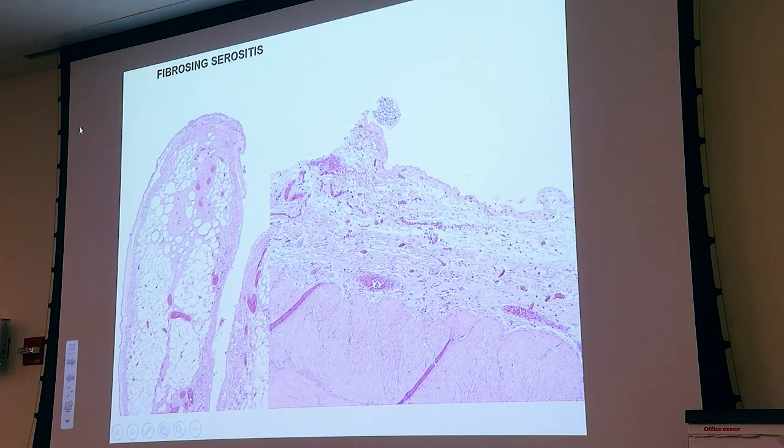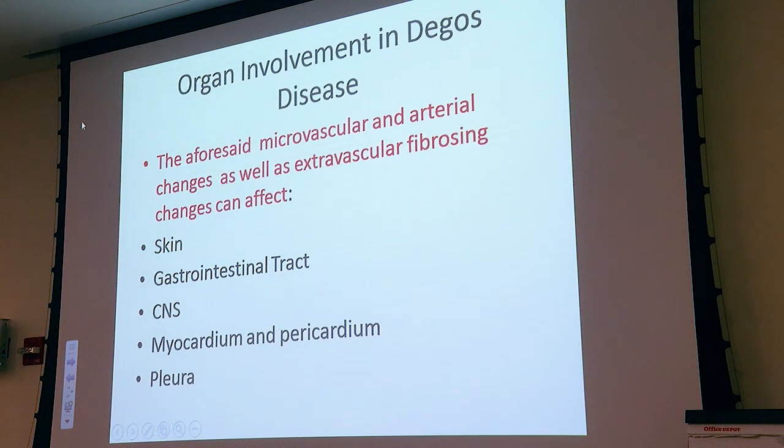And this is the subserosa, showing over and above the arteriopathy I alluded to, the interesting pattern of fibrosis and mucin deposition within the subserosa. That is another integral component of the pathology, very much akin to the skin, where we have the vasculopathy, but also the ensuing dermal fibroplasia.